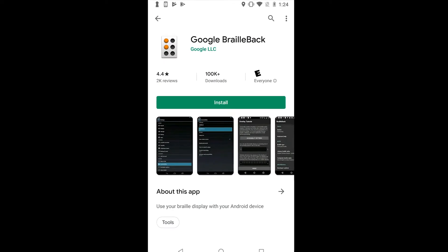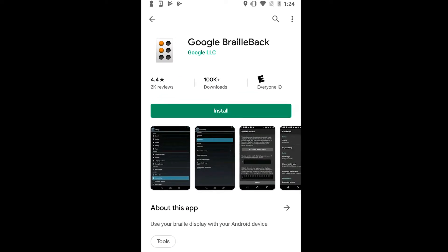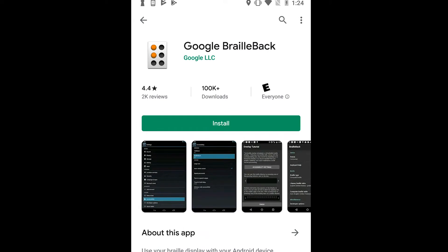First, ensure that you have the BrailleBack app downloaded to your Android phone. This app can be found on the Google Play Store.